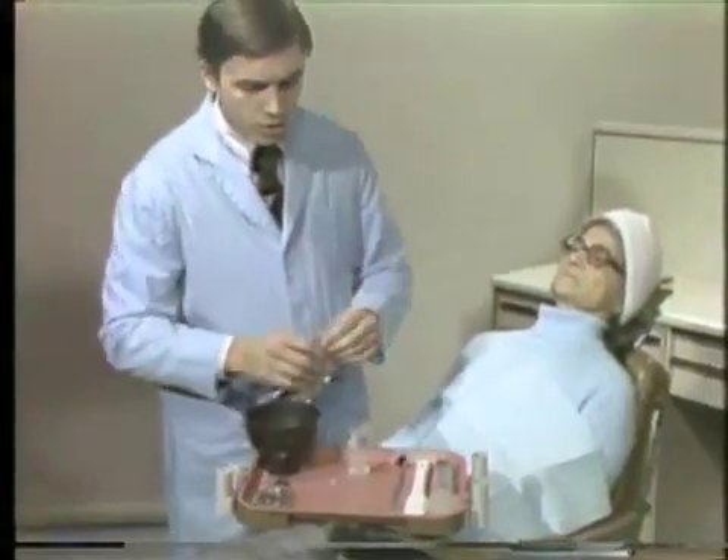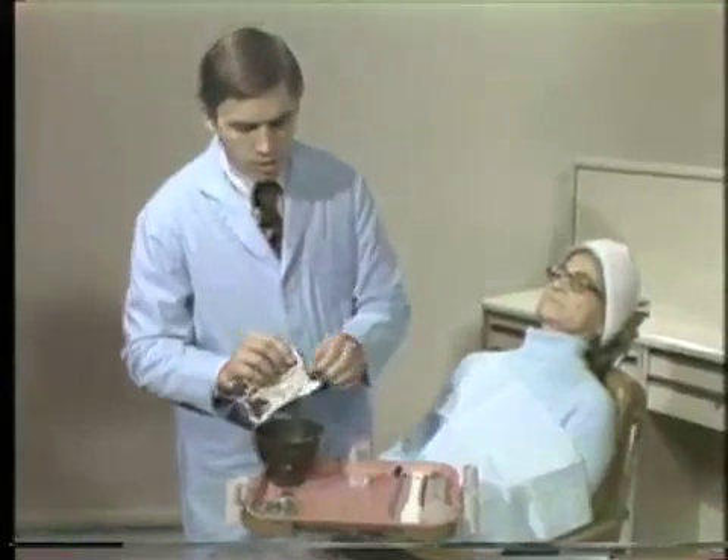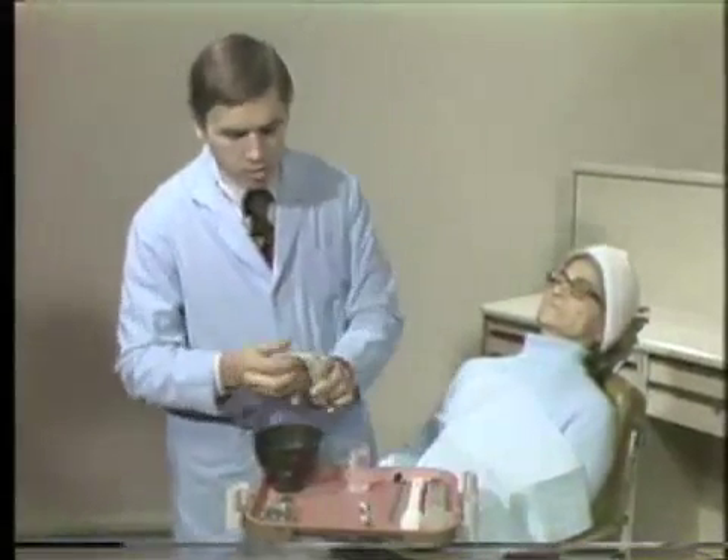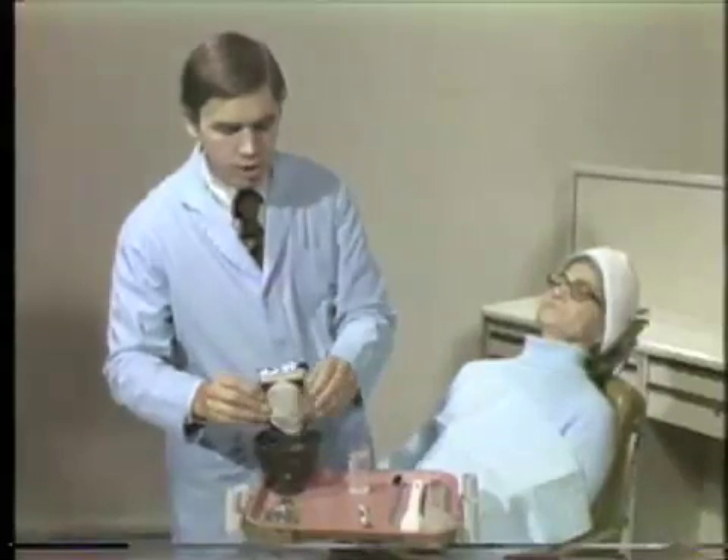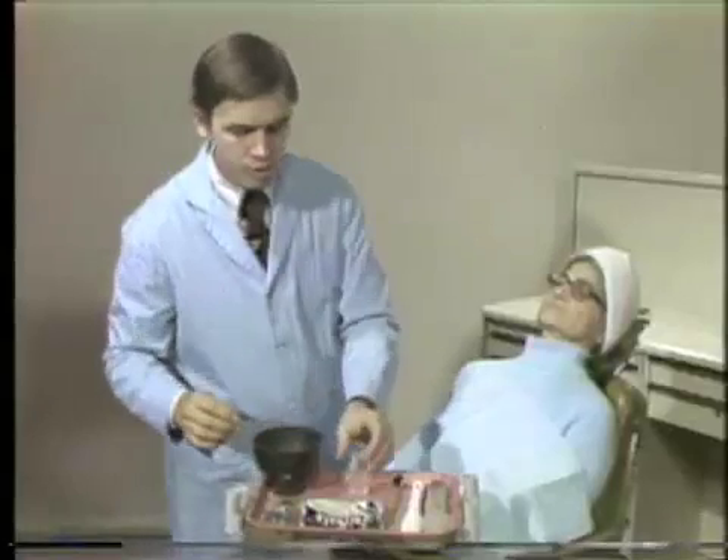The consistency of the alginate is very critical. One must first incorporate the water and powder and then spatulate until it reaches the appropriate consistency.